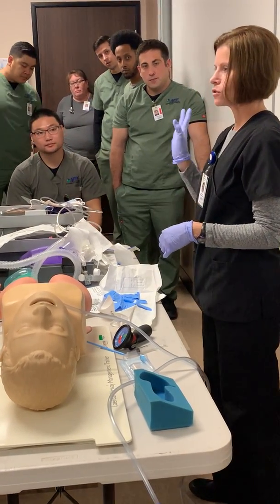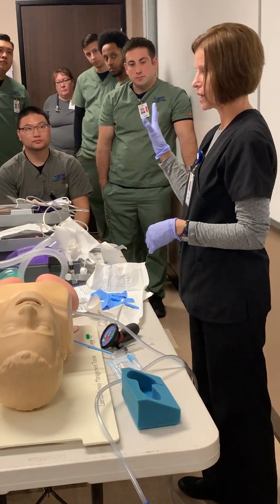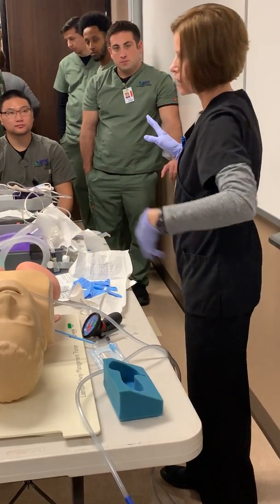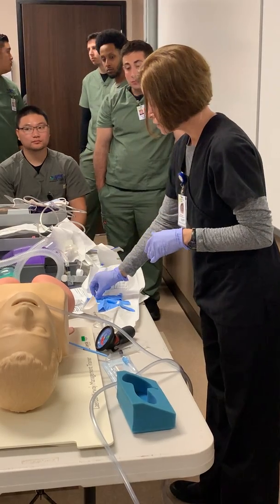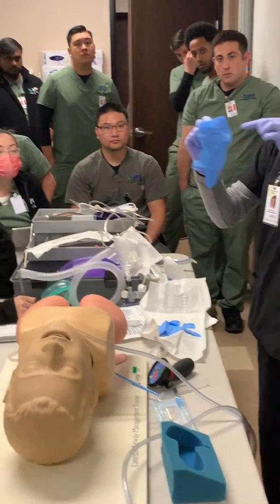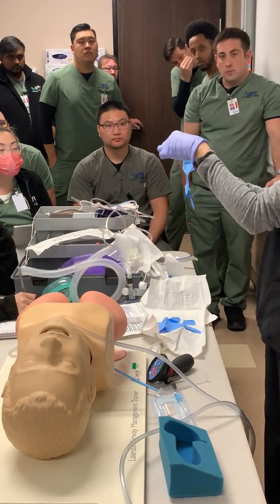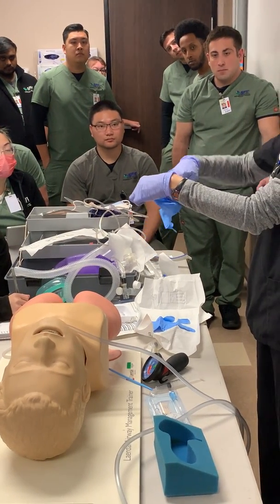I'm right-handed, so I only put a sterile glove on my right hand so that I remember this is my sterile hand. This is my hand that I could hold the patient's head down. I could answer my phone if I had to. Worst case scenario, this is my sterile hand. On these gloves, there's a part at the top that's folded back that I can touch. I can't touch down here because this is sterile. So with this hand, I'm going to stretch it open.